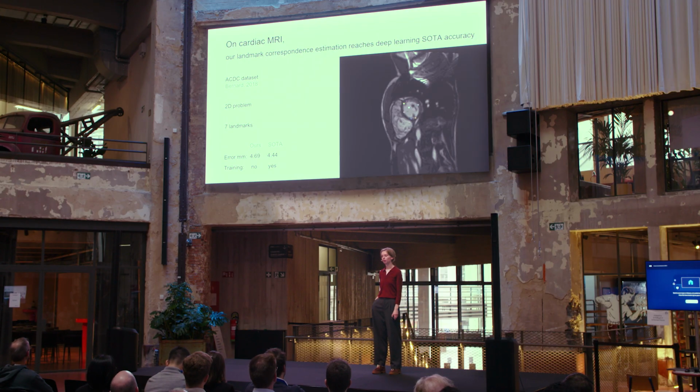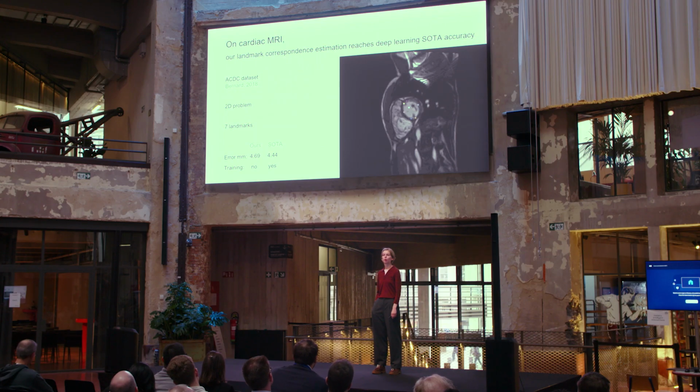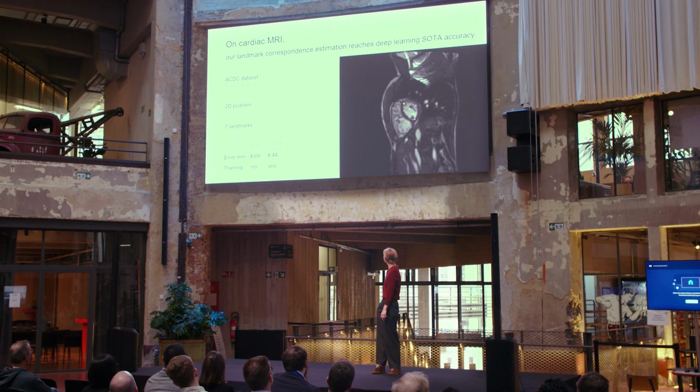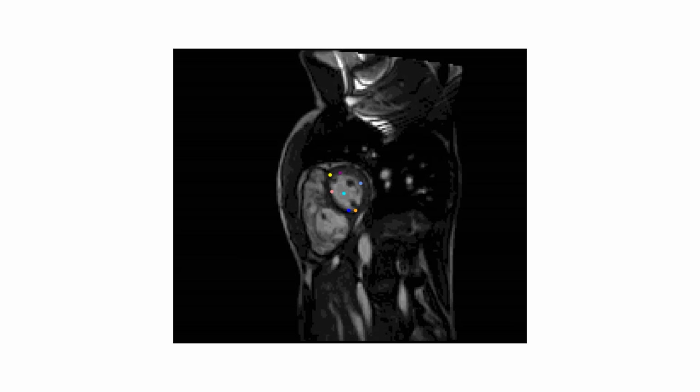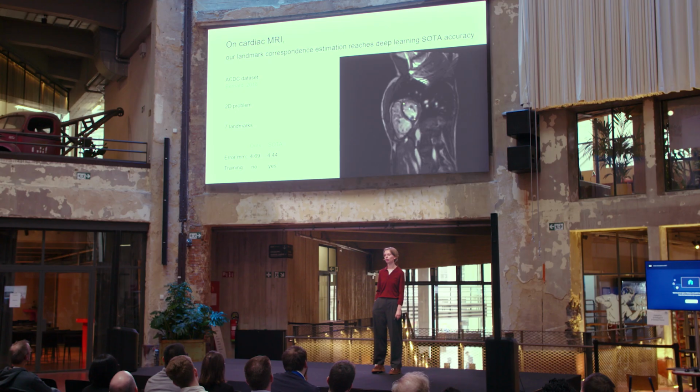to the end of the cardiac cycle. When we compare our approach to a state-of-the-art deep learning model that is specifically trained for this task of correspondences, our approach is able to achieve similar accuracy. Importantly, it does this more efficiently, since our approach requires no additional training time. And our results look like this. As you can see, our estimated landmarks are able to capture that cardiac motion, that beating of the heart.